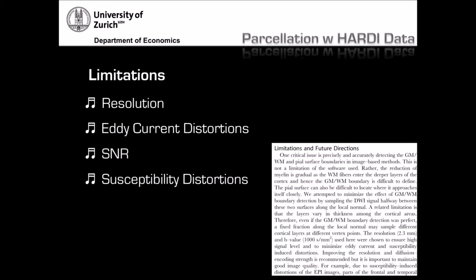So there are a lot of areas where you run into partial volume issues. There are, of course, eddy current distortions, SNR issues, and susceptibility distortions, all of which make this procedure very hard and very error prone, and these steps also introduce systematic errors.